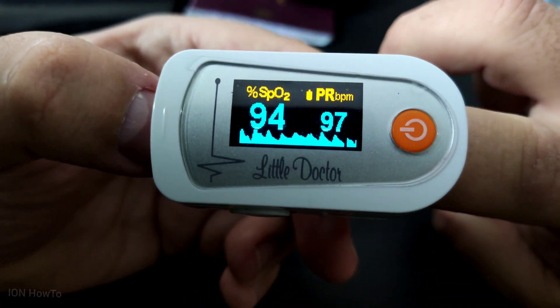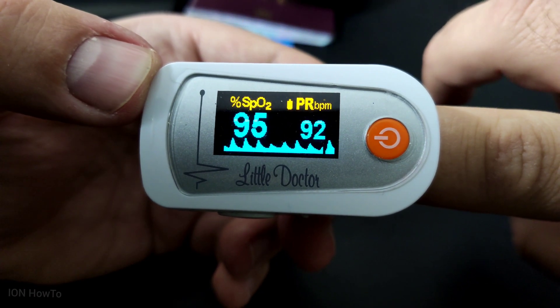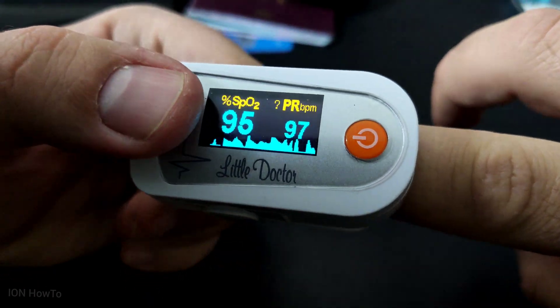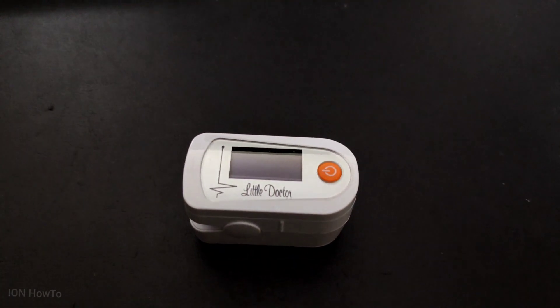On the left is the oxygen level and on the right is the pulse. The pulse will go up and down depending on how active you've been in the last few minutes.